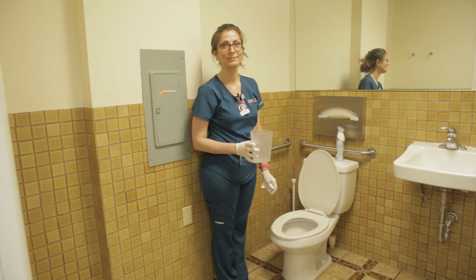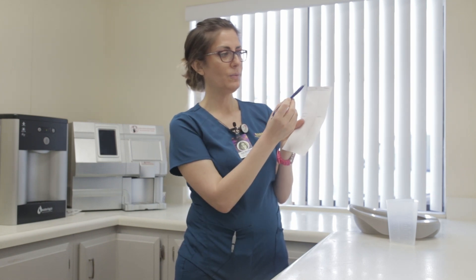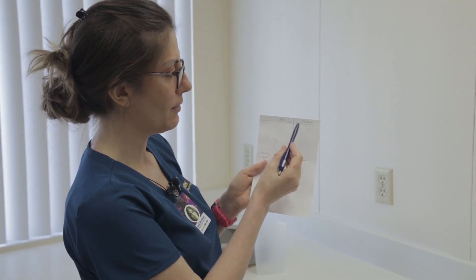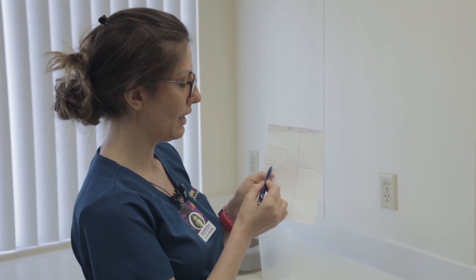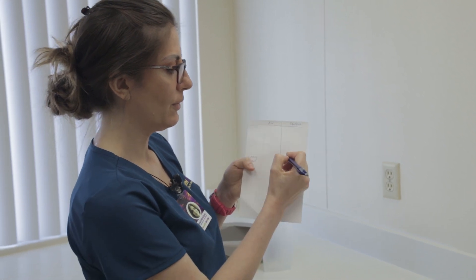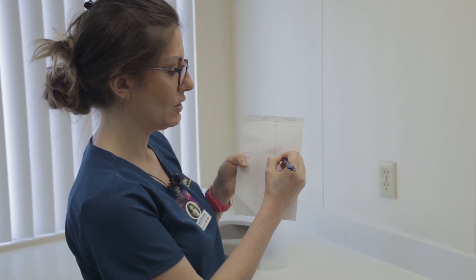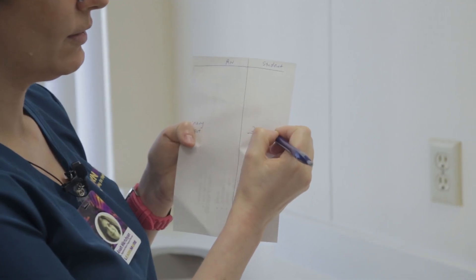After washing your hands, you are ready to record. You will see it says 'RN' on top and 'student' below. Record next to the line that says 'urinary output' underneath 'student.' The reading we recorded was 250 milliliters.